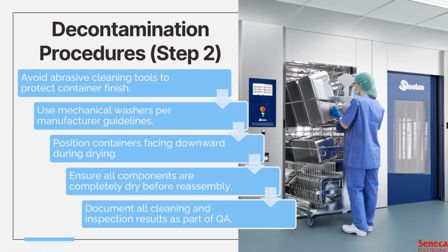So back to the manual cleaning that I mentioned. For the most part, we don't do much manual cleaning on containers unless they have hardened blood or other kinds of debris on it. Otherwise, if it looks clean, we put it in the automated cart washer.